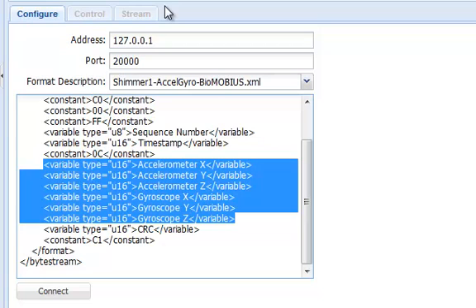For Shimmer firmwares that do not have a corresponding format description file, you can select an existing one and modify it as needed. You can find more information on the SensorMonkey support page. I'm now going to click Connect.